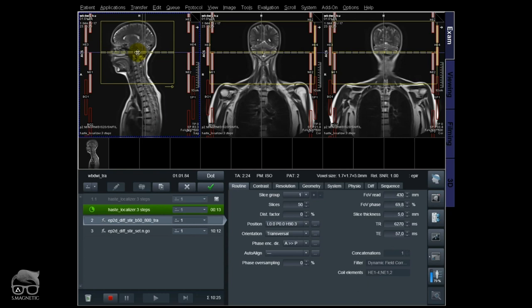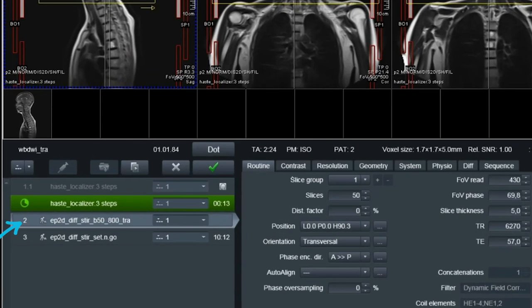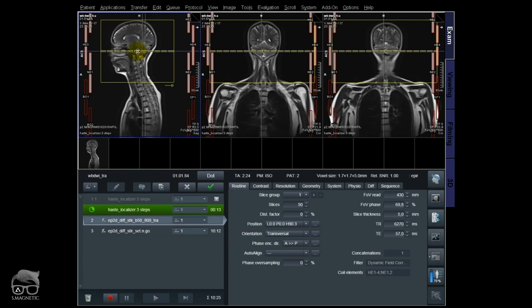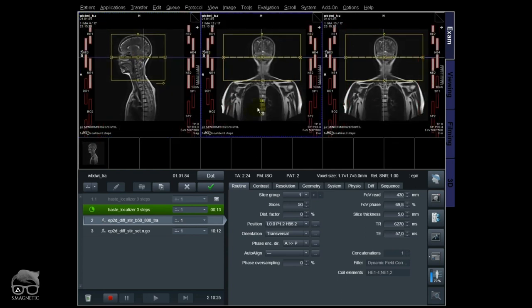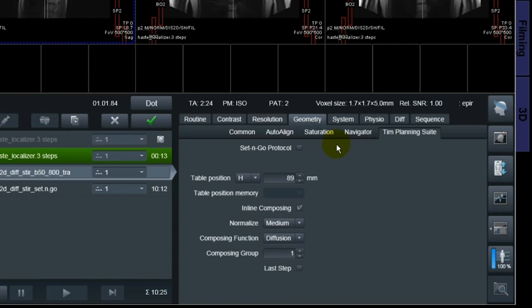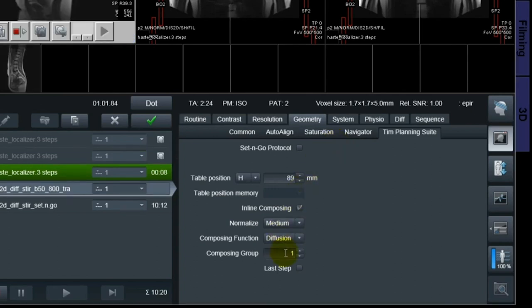Starting here, you have a few options. You can see sequence number two — it's done manually, one step at a time — and then I have 'Set and Go,' which I'm going to show you later via TIM planning. While the localizer is running, I'm planning my first diffusion step right now so there's no dead time in the scanner. In the TIM planning suite — this is an option when buying a scanner — it's easier to plan sequences when you have multiple steps.